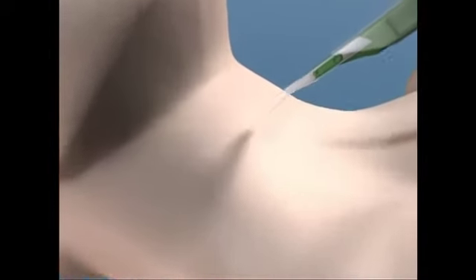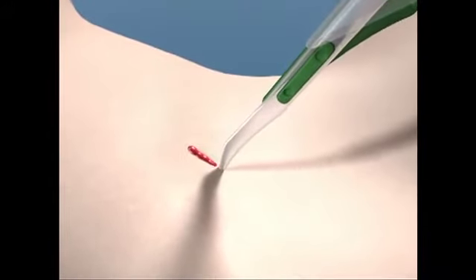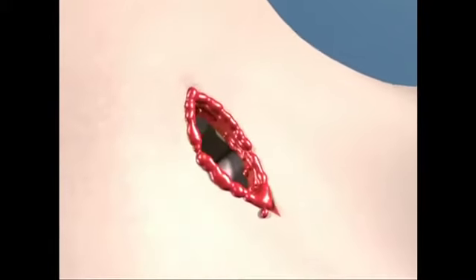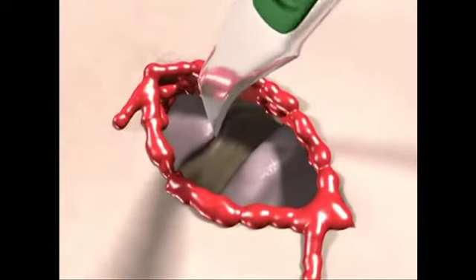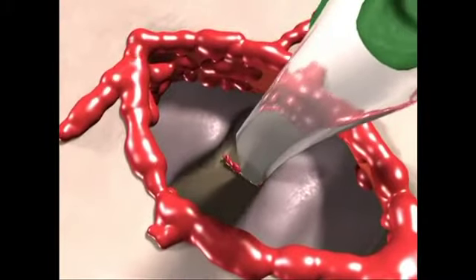Using a scalpel, make a vertical incision through the skin large enough to accommodate the Shiley tube over the cricothyroid membrane. If necessary, spread the soft tissues to better visualize the cricothyroid membrane. Find the cricothyroid membrane and make a 1 centimeter incision in the horizontal plane through the membrane, avoiding any nearby nerves, arteries, and veins.